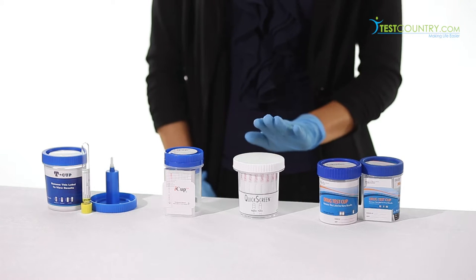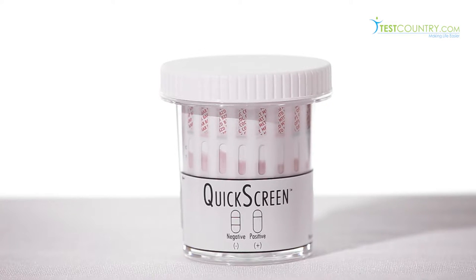The Quick Screen Cup is made in the USA, tests for up to 12 different drugs, and is CLIA waived and FDA approved.